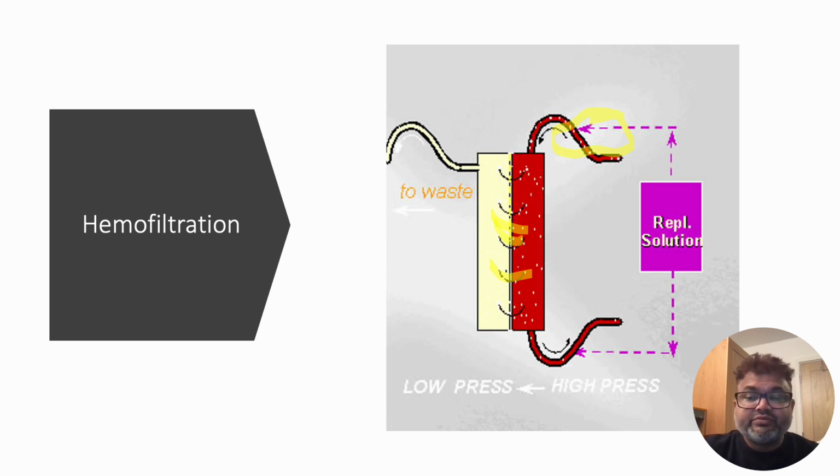The fluid which is being mixed in the blood can be mixed in before the filter or after the filter, and that's why we call it pre-filter replacement fluid or post-filter replacement fluid.